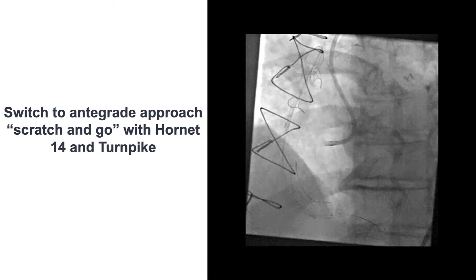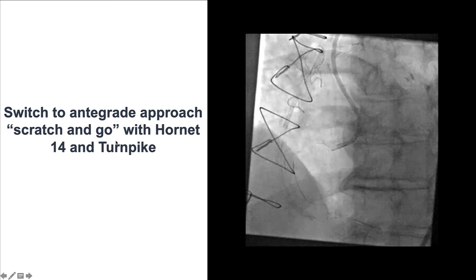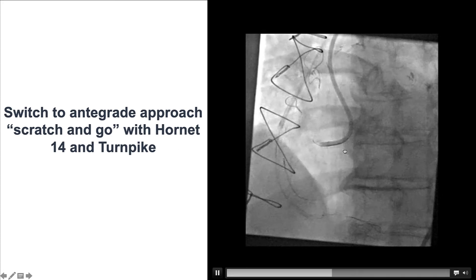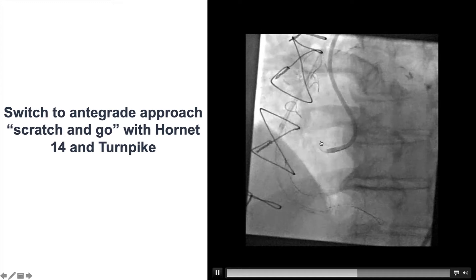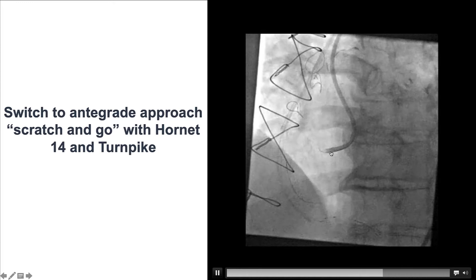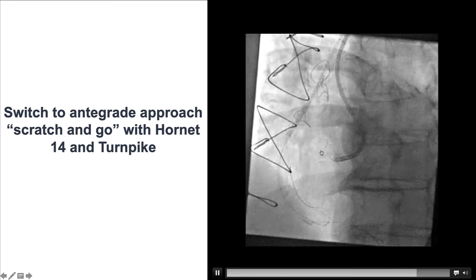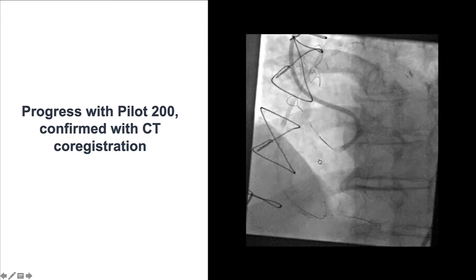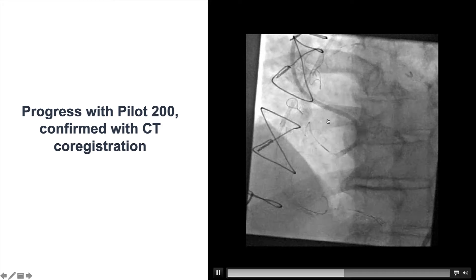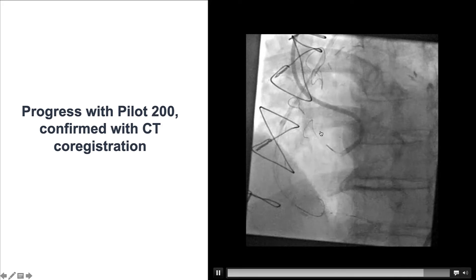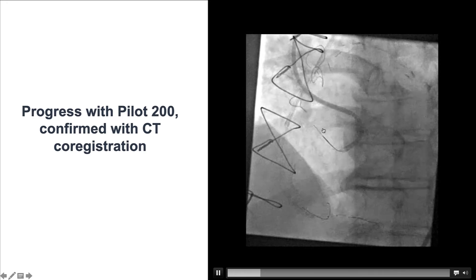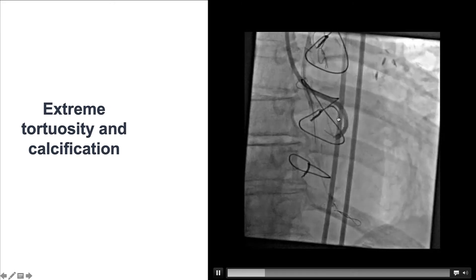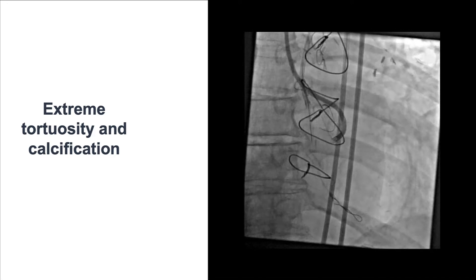We had difficulty making progress, so we decided to switch back to the antegrade approach using the Scratch and Go technique. In this technique, a stiff guide wire creates a sub-intimal entry point, and then a microcatheter and polymer-jacketed wire are inserted to track through the sub-intimal space. A Pilot 200 was advanced — the wire course looked unusual, but based on co-registration we confirmed it was the true course of the vessel, going up and then turning down. Co-registration provided reassurance we were in the right place. Additionally, using a knuckle wire provides a safety margin, as knuckles are unlikely to perforate the vessel.